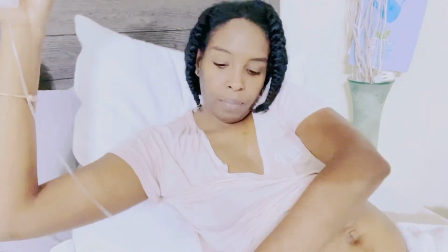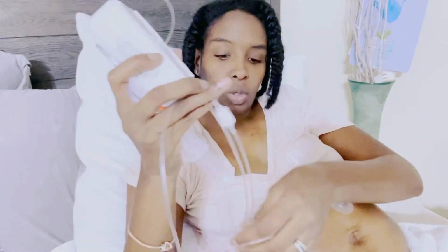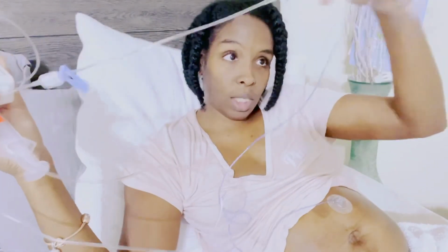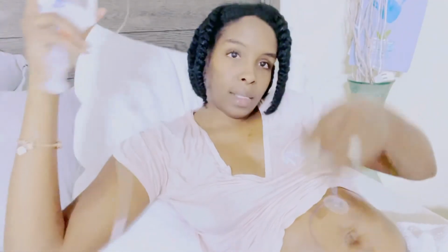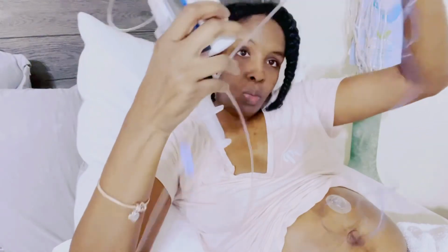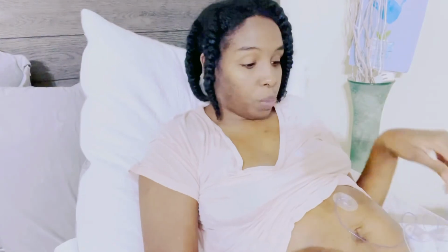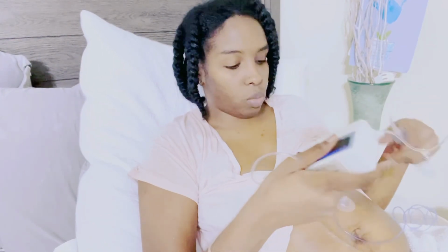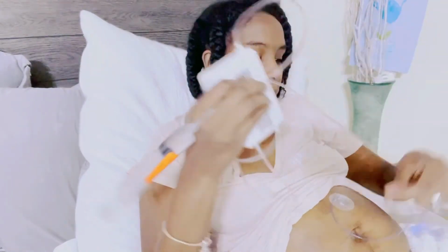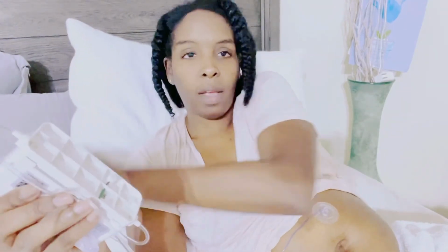We're connected. You know, if you did clamp this, make sure you unclamp it so the medication can get through. And that is that. See, I'm connected to my tubing, to my machine. And before you put your syringes on, you have to play with them, loosen them up a little bit for the machine to not get clogged as well. So that's that. And I could put this back in my little pouch they gave me if I want.